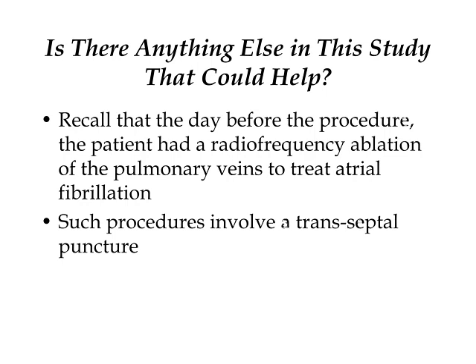So is there anything else that can help us here? Well, remember, this patient had an atrial fibrillation catheter ablation the day previously. AFib ablations usually involve, perhaps always involve, a transeptal puncture, because the access is through the right side and then you have to get over to the pulmonary veins. So it means you have to go through the interatrial septum. Can we take advantage of that? Well, in this case we could.